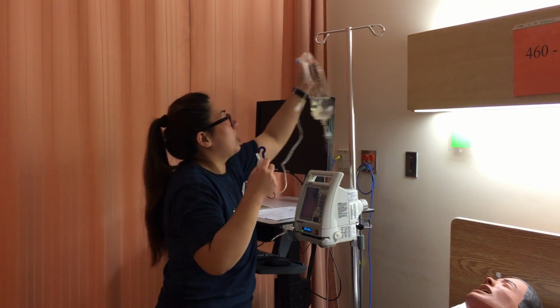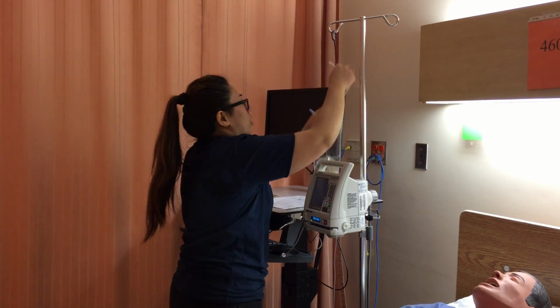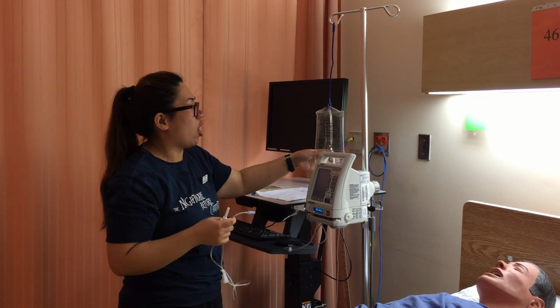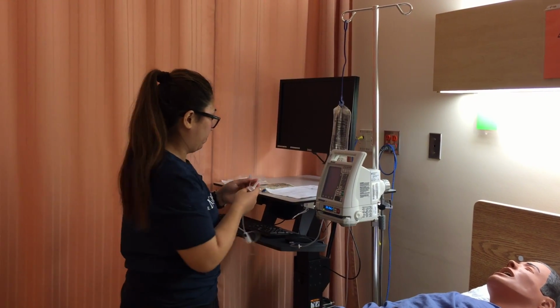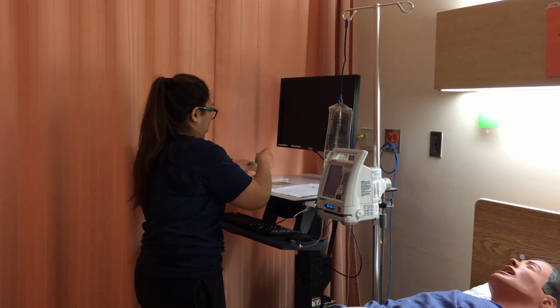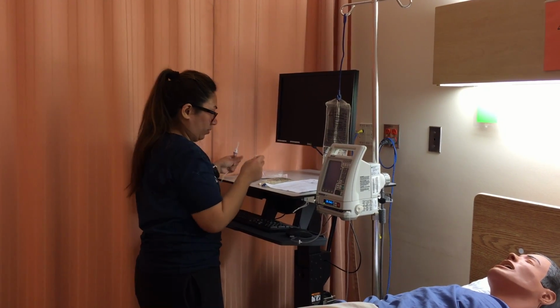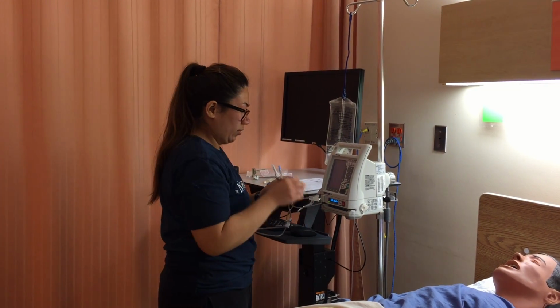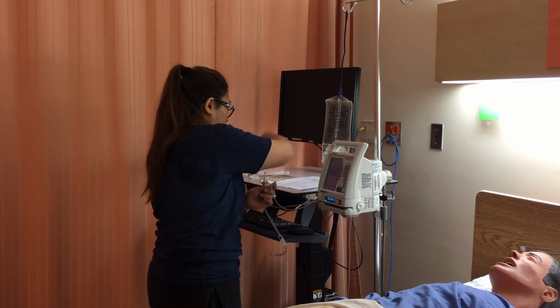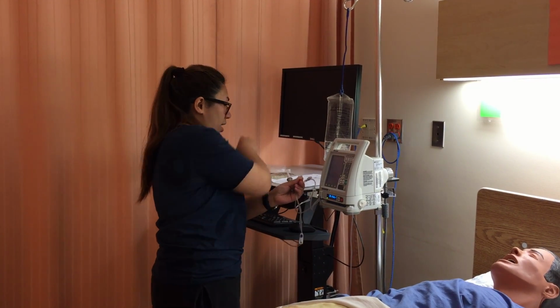We're going to hang our primary lower so that when our secondary medication is done, it would run on its own through gravity. First, we're going to clean our port for about 30 seconds, and make sure both ends are clean and sterile.